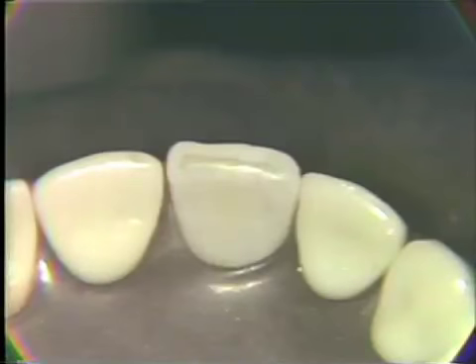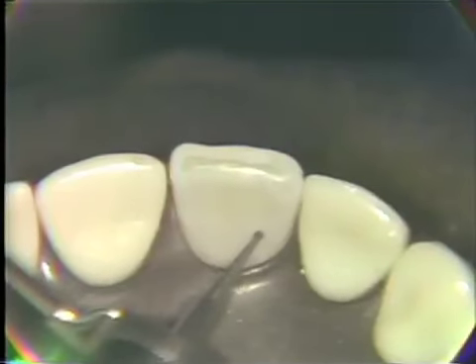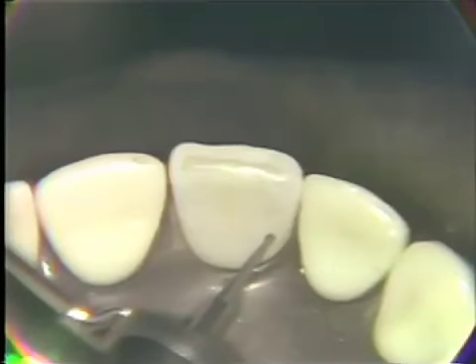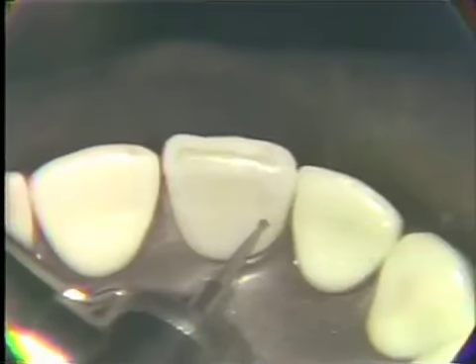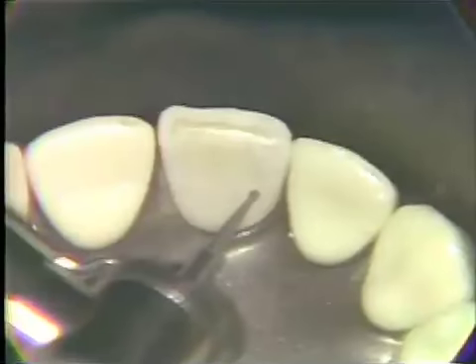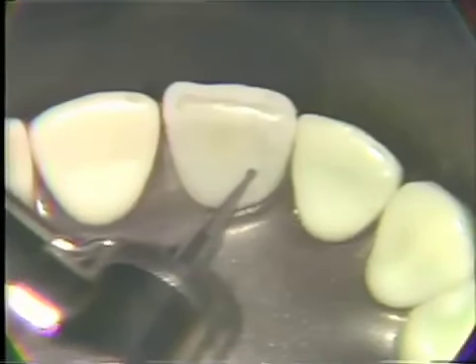We're going to be using high-speed instrumentation, using first a number 1/2 round burr to make our penetration, initial extension into the carious lesion. As we do this, we want to have the burr paralleling that proximal surface, placed directly over the lesion, approximately 90 degrees to that lingual surface, and we can initiate preparation. We'll be using an air water spray and vacuum in order to keep the area cleared.